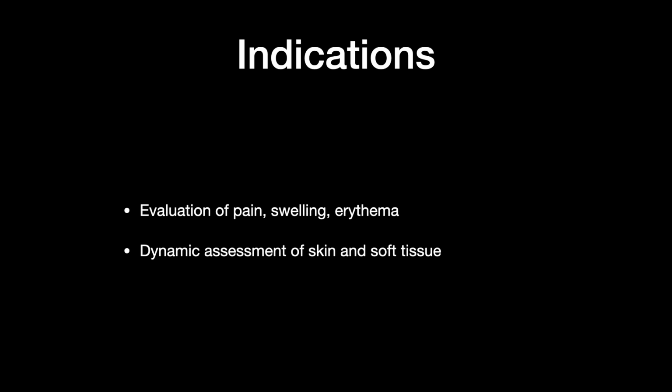I don't have that ability with my two eyes to peel the skin layer back and see what's going on underneath. But with my ultrasound, I can come to the bedside and really peel that back and say, okay, here's what is going on, and here's what I need to do about that.